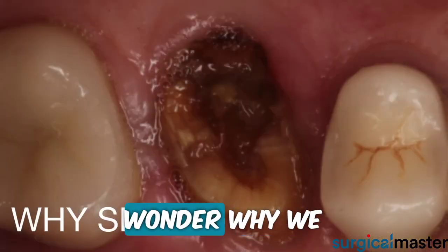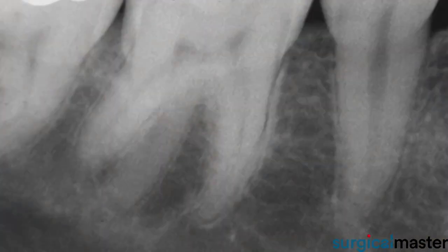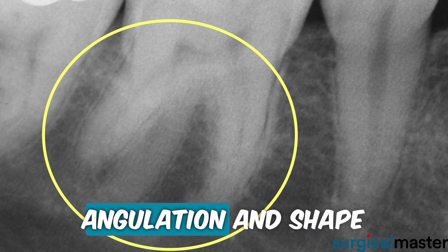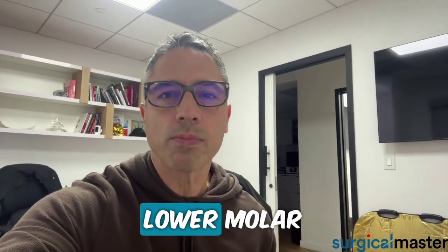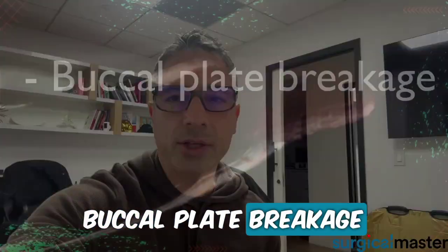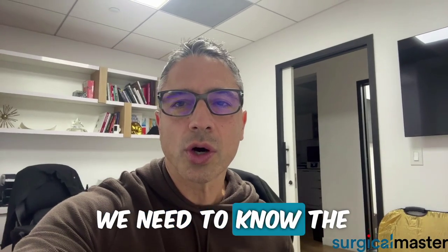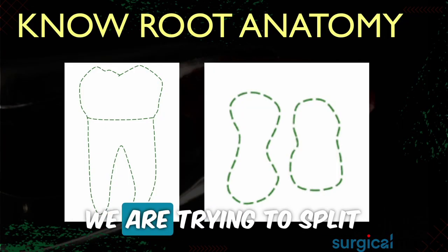Did you ever wonder why we need to split between roots? Molars are like anchors in the jaw, and each root has its own unique angulation and shape. We all know that delivering an upper or lower molar without splitting often leads to buccal plate breakage or root fractures. To split successfully, we need to know the cross-section anatomy of the roots — the very anatomy we're trying to split. So let's start with a lower molar.